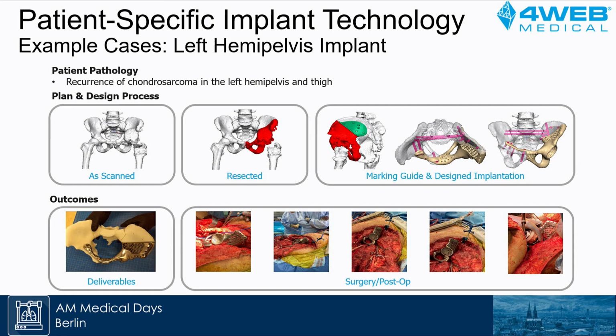The image of the second row shows the anatomical model printed in plastic, along with the implant printed in metal, and the implant was placed, and the patient is doing very well.